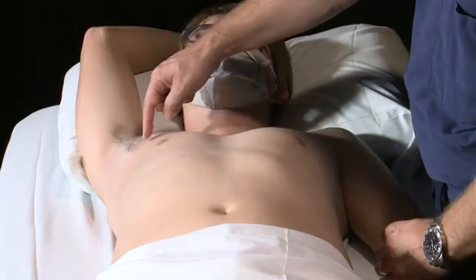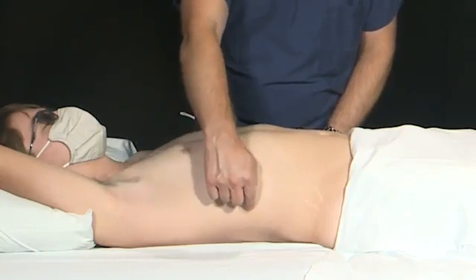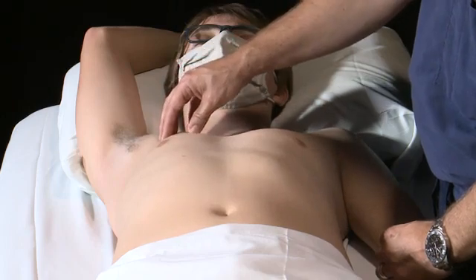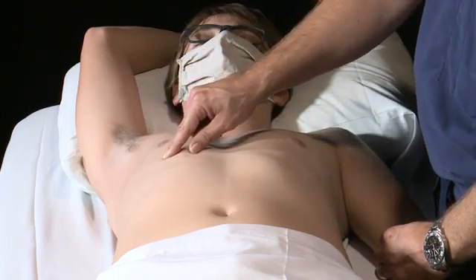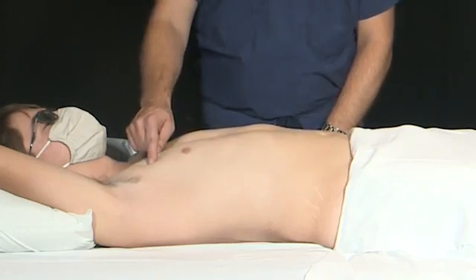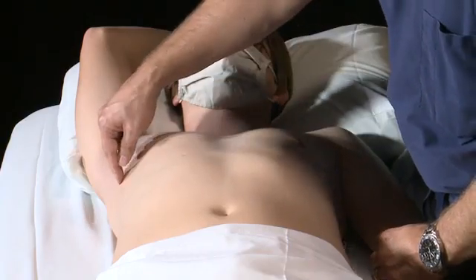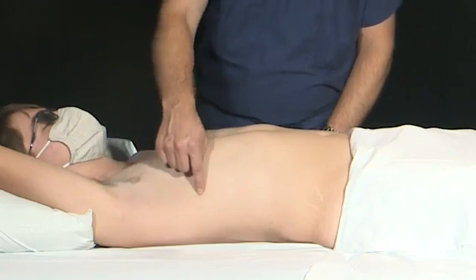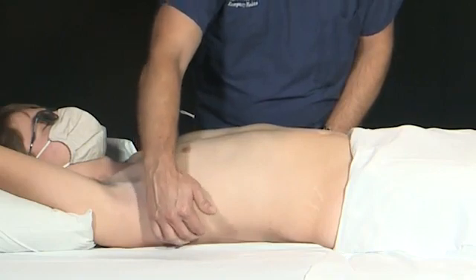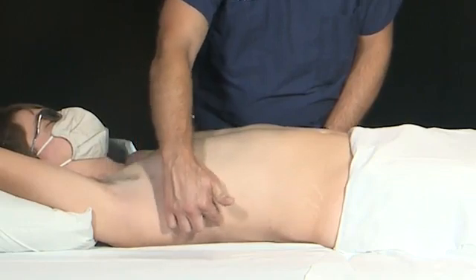We're going to do this by drawing a line at the anterior axillary line and another one at the posterior axillary line, then image the lung all the way from superior to inferior along each of these zones. We'll start the probe at the superior anterior portion of the chest wall, imaging down through the lung, then move laterally — starting superiorly and moving inferiorly — and in the posterior area, just beyond the posterior axillary line, we'll also image superiorly to inferiorly.